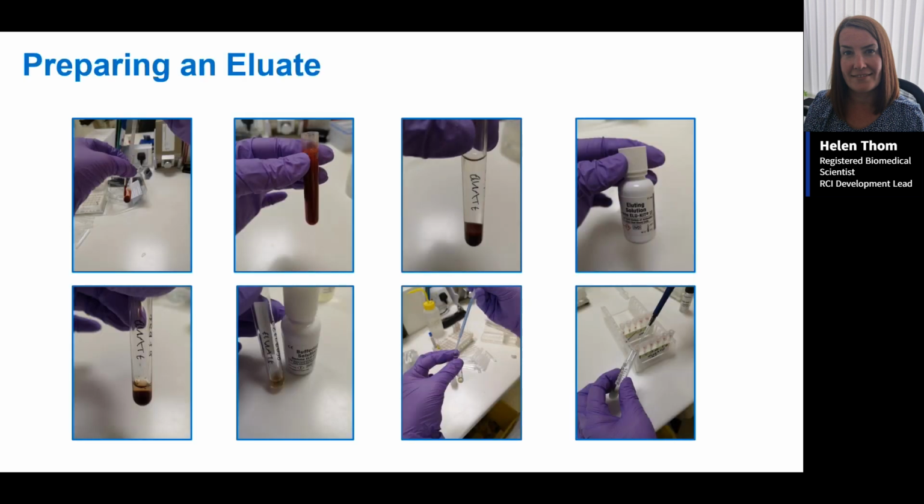And I've just got a few little images here of me performing an eluate years ago. I just took some pictures, just so you can try and see what's actually going on, because if you don't perform them, you might not know. And I'm talking about washing red cells and stuff, you might just think I'm a bit mad. So hopefully it's not too small on the screen there.